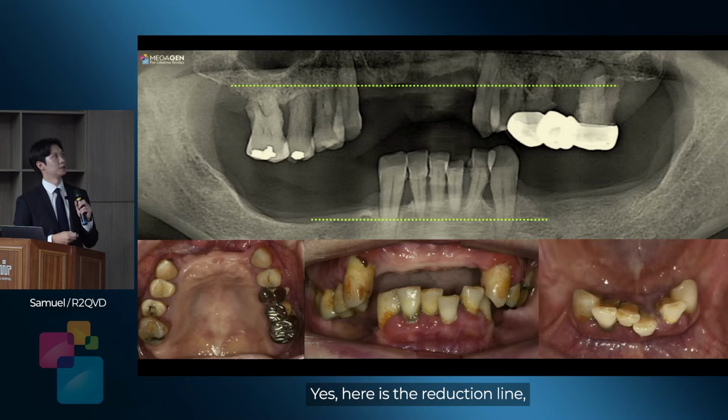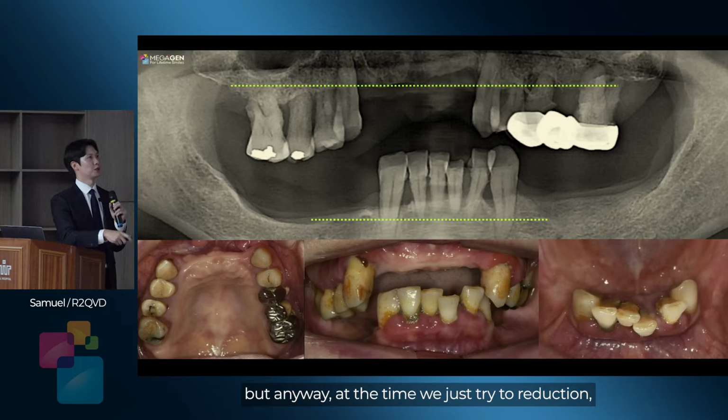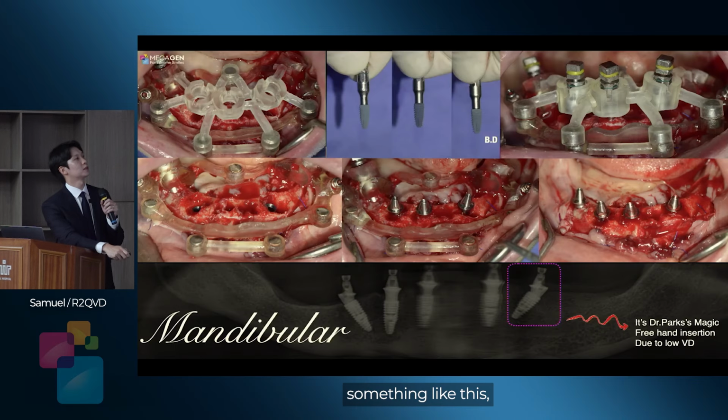Yes, here is the reduction line. But nowadays we don't need to do reduction, right? But anyway, at the time we just tried reduction with the stackable guide, something like this.